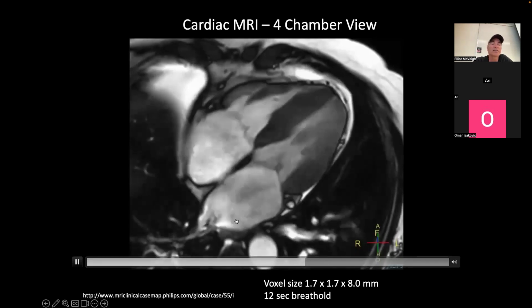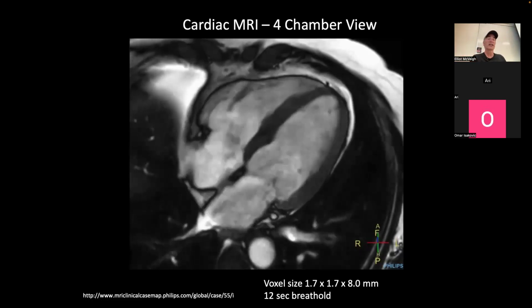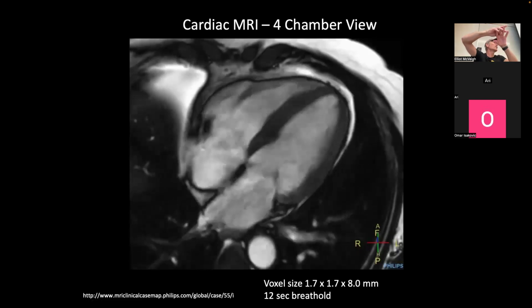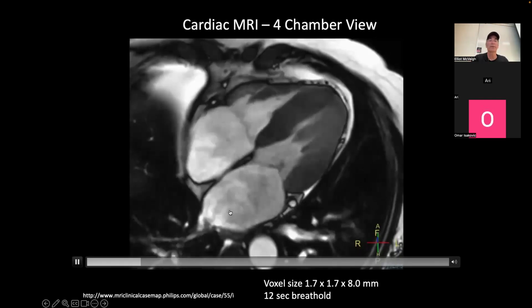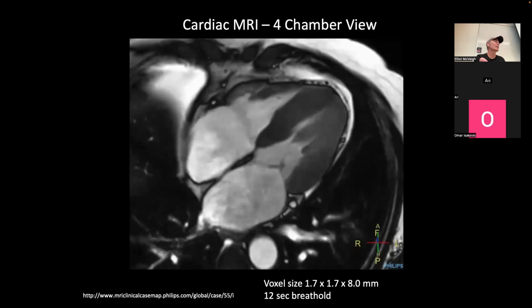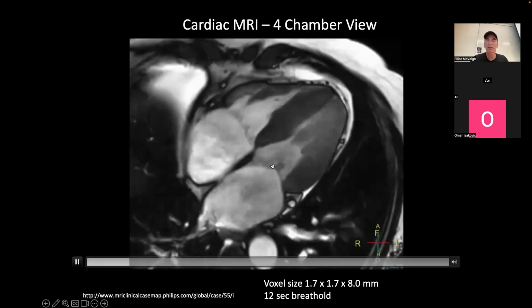And the really interesting thing is if this circulatory motion, this swirling motion, was not reproducible, if it wasn't exactly the same for the 16 heartbeats that were used to make this movie, the signal would not be encodable because it's not reproducible from one beat to the next. And what it would look like is just a vertical hash of signal up and down because it couldn't be phase encoded, right? Because the amount of phase depends on the velocity. What would happen is this whole thing would just wind up as a streak up and down here. It doesn't. Therefore, that flow that you see there is reproducible beat to beat by definition, right? Otherwise, we couldn't image it, right? Which is kind of cool, right? That it looks kind of like it would be random, but it's obviously not random, right? Same with the flow up here, right?